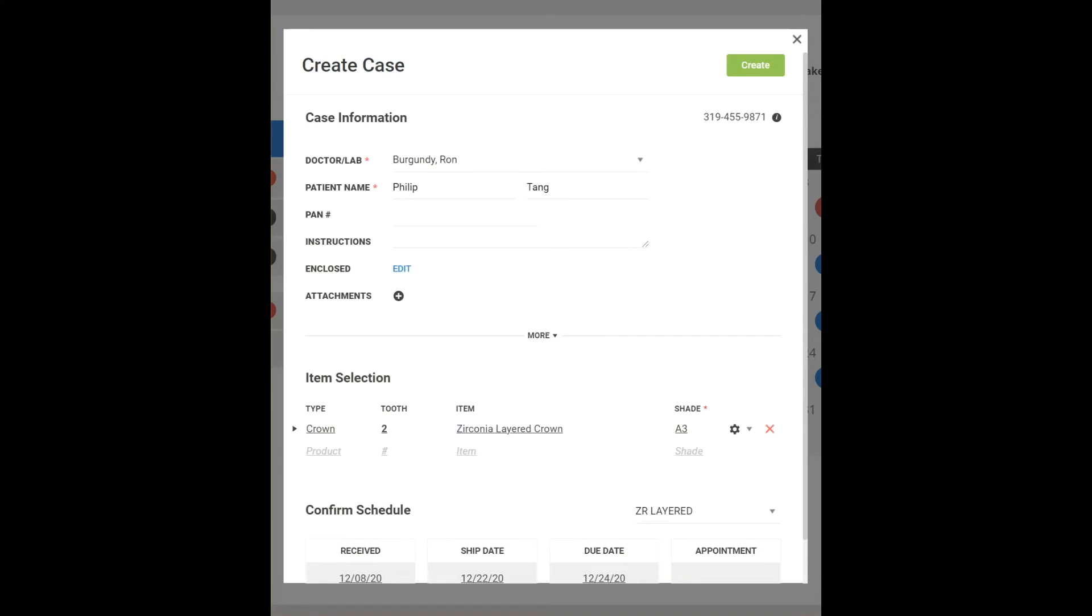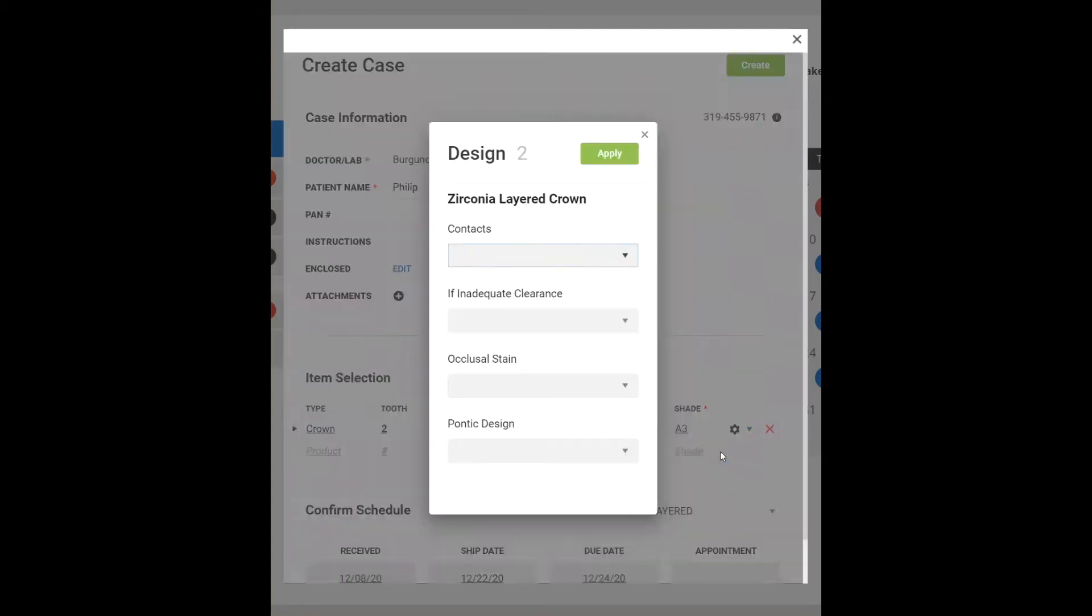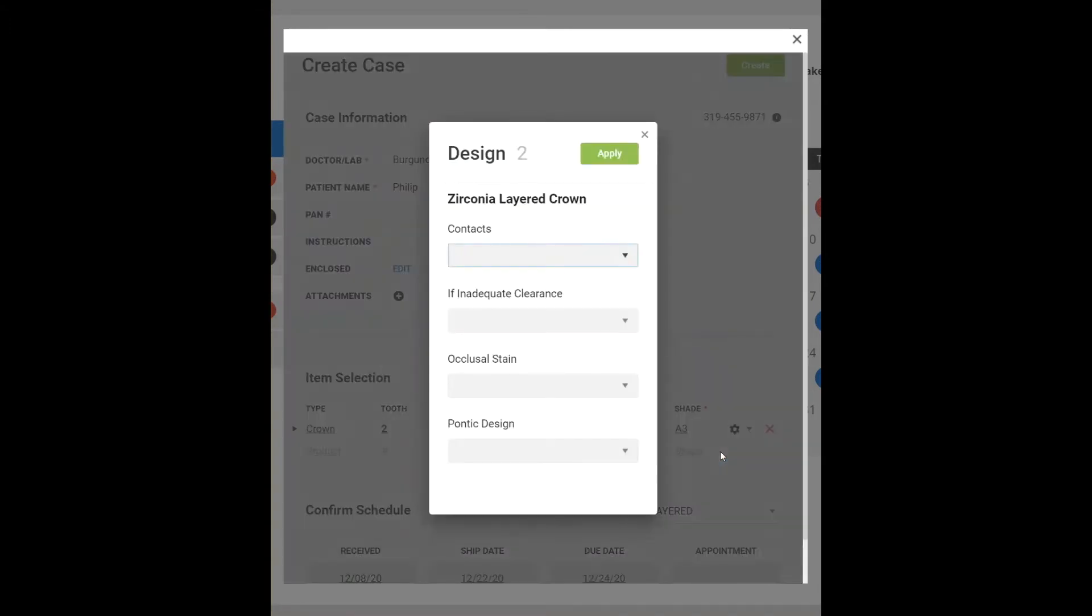Hello and welcome to part two of the eight-part Mastering LabStar Case Entry video series. In this segment, we discuss how to create your own designs so that technicians always have the design instructions they need on the work ticket without having to call your doctors for more information.